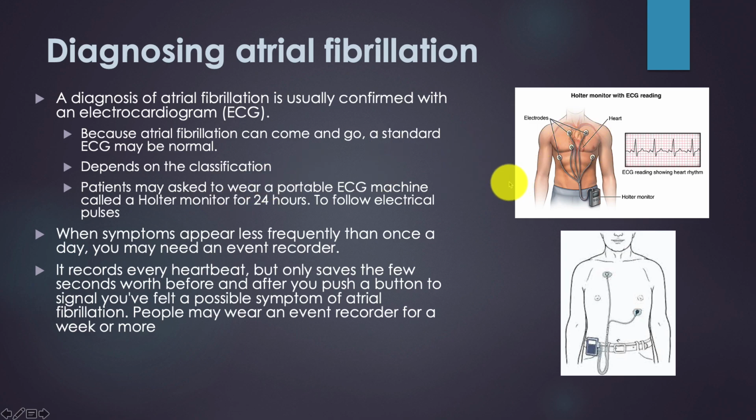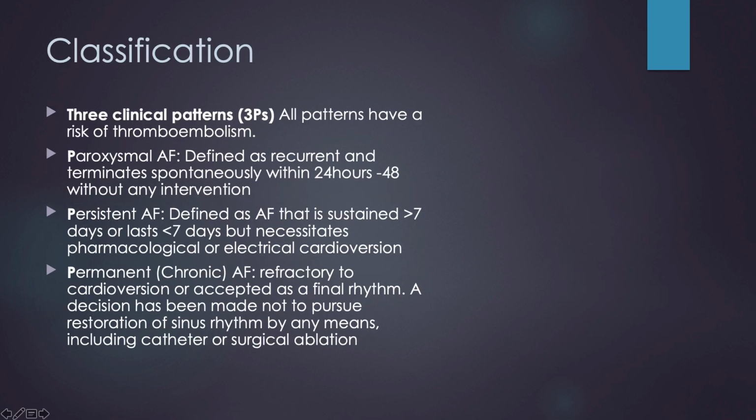So what the ECG is going to do is essentially draw us a picture on graph paper of the electrical impulses that are traveling throughout the heart muscles. What's great about this is it's really an electrical snapshot of the heart. And for people who have symptoms that might come and go, right? If we talked about intermittent bouts of AFib, right? Let me go back here and just say, these individuals here, this would be easy to do an ECG or EKG on.